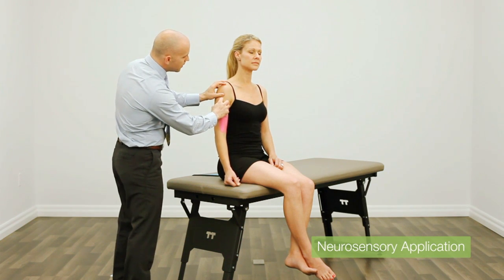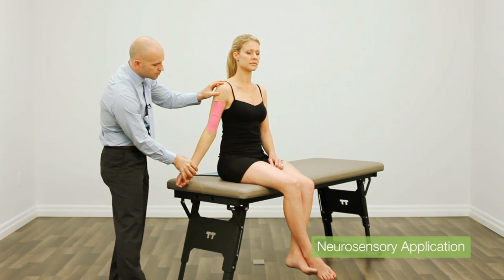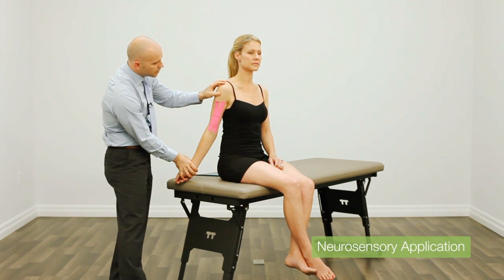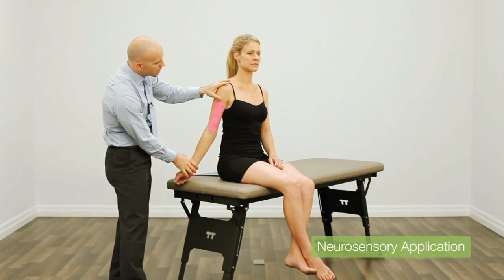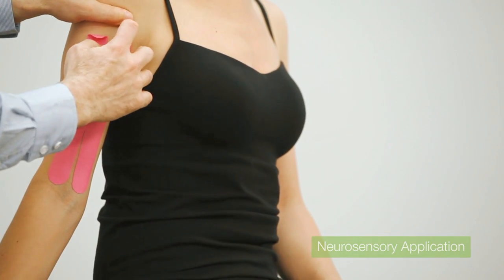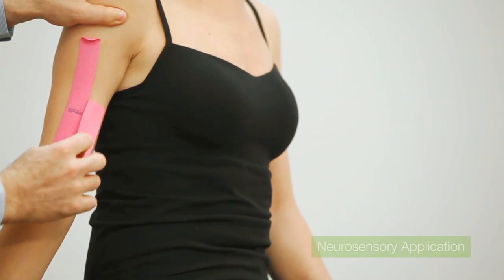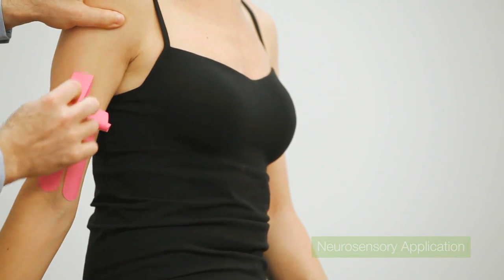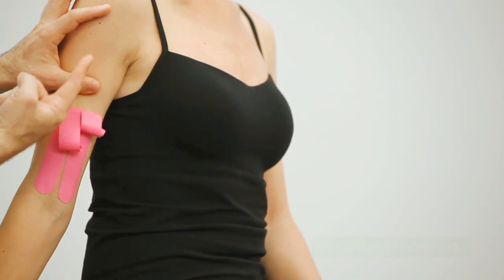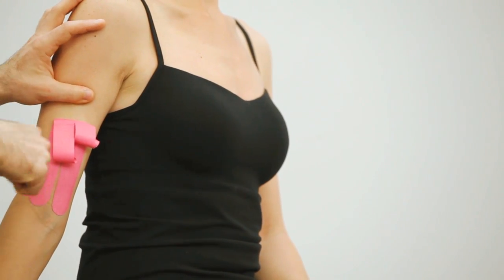To gently remove the tape, I'm going to once again put the arm in a lengthened position, stretch the skin underneath the tape, and peel the tape back — always moving the skin in the opposite direction from which I'm removing the tape.